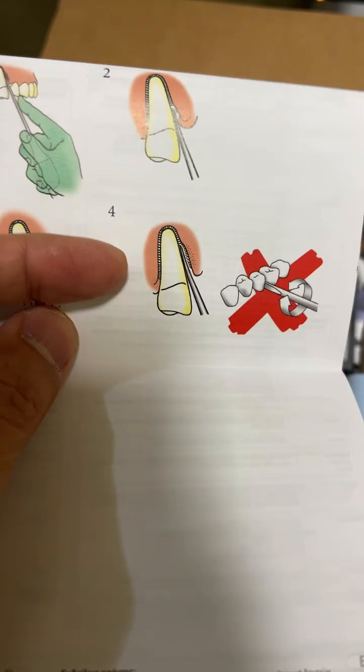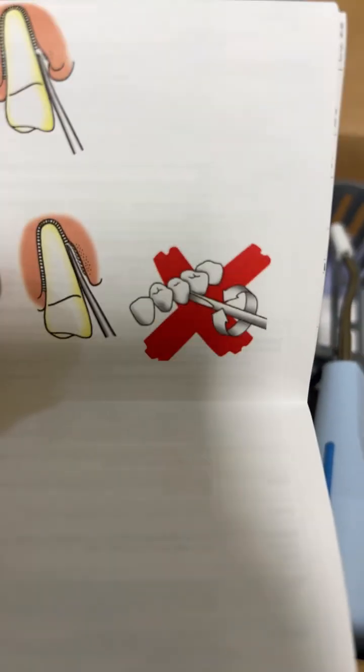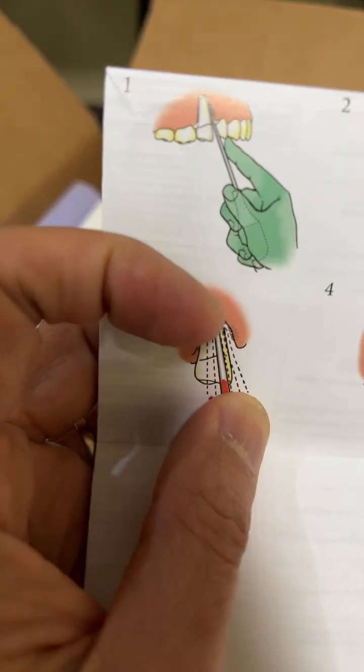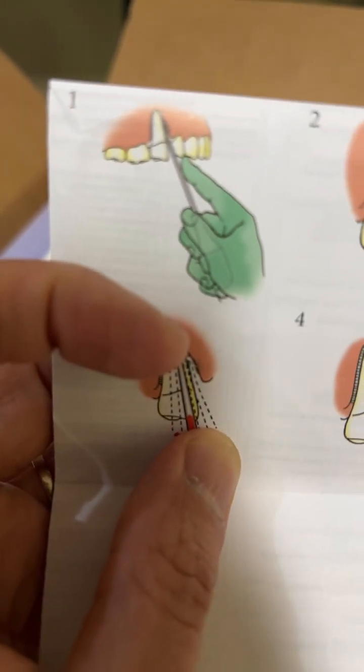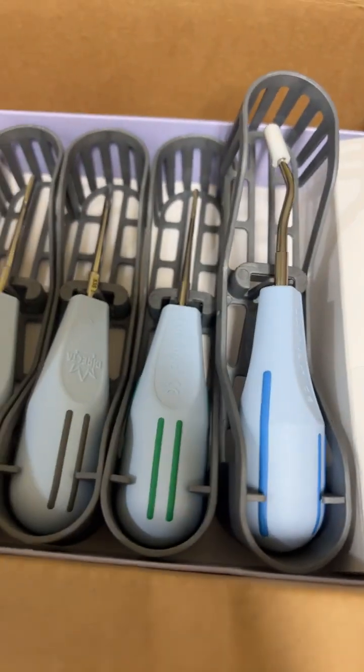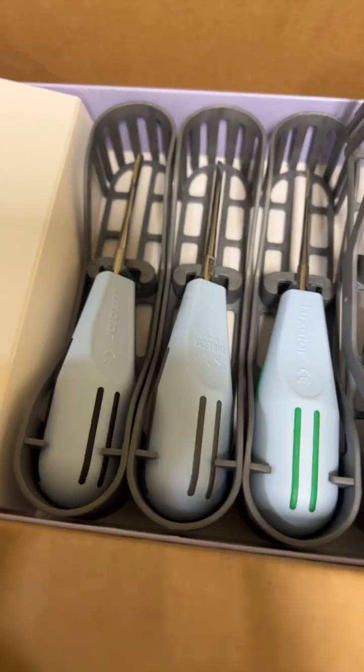Then finally you move and take out the tooth with forceps. This is what you don't want to do — when you do this, you can potentially damage the adjacent tooth. Use your finger rest — that's how you do it properly.